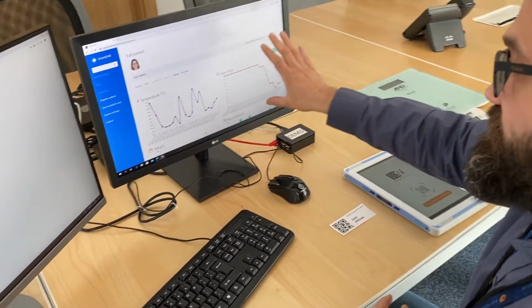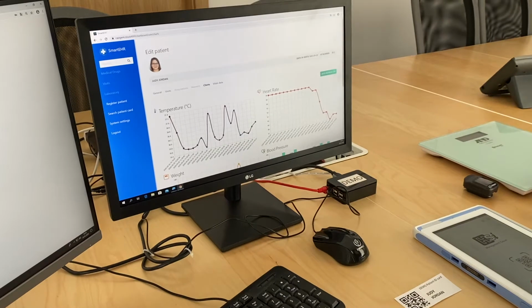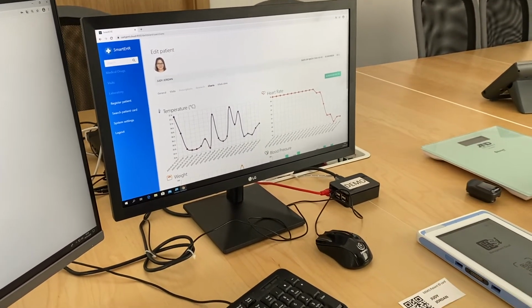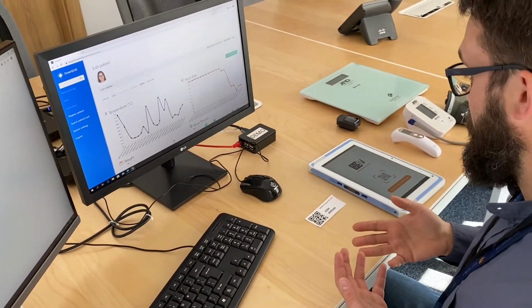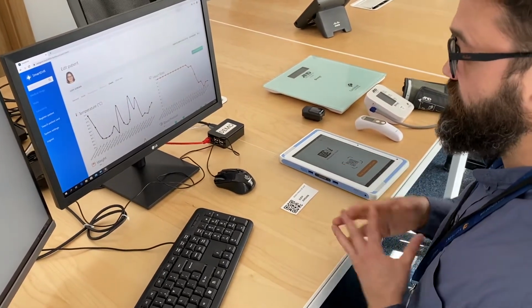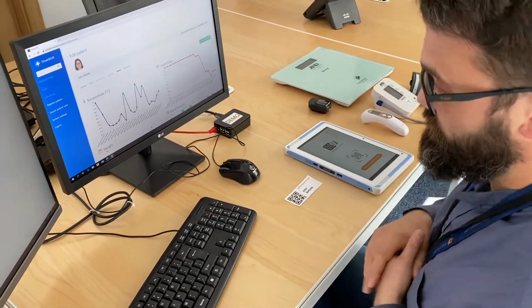I have an instance of an electronic health record system, but you can envision here any commercial electronic health record system that your healthcare organization is using, as long as it's enabling us a RESTful API or can communicate with HL7, our solution is flexible enough to integrate with it. So we can envision here, for example, Epic or Allscripts.